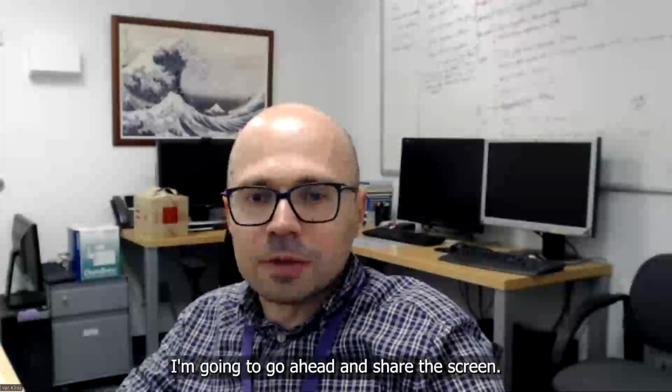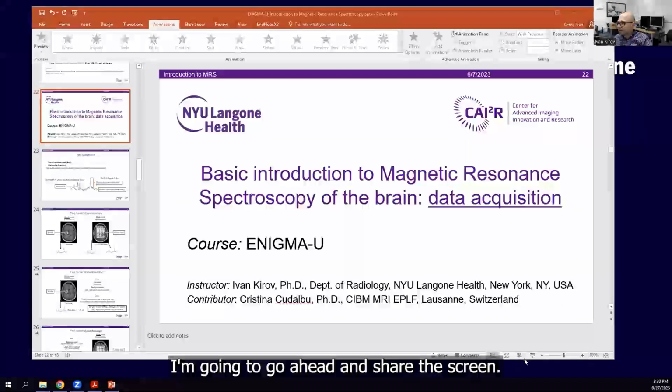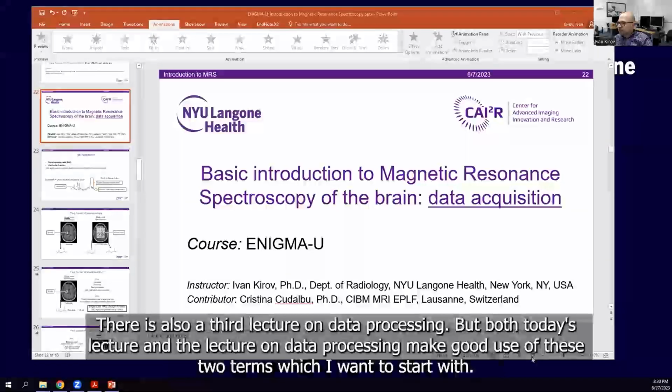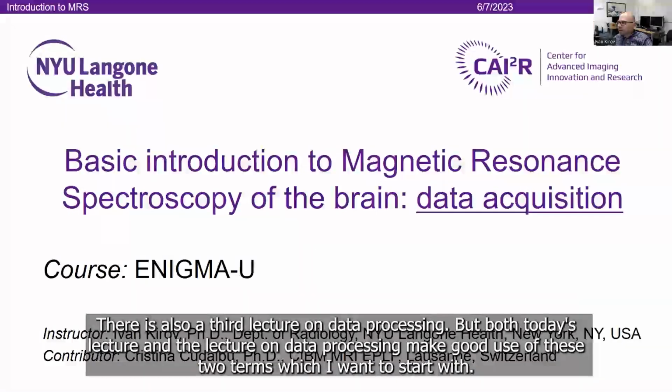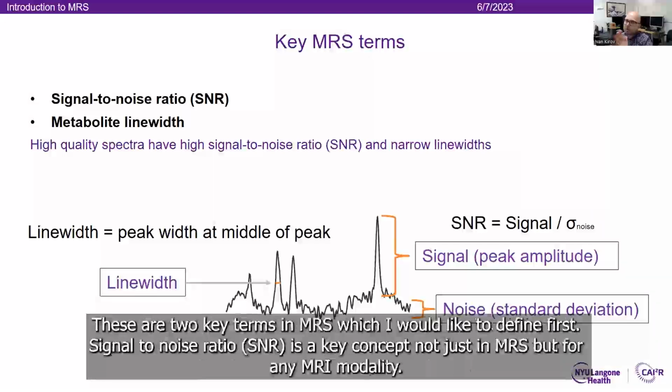I'm going to go ahead and share the screen. There is also a third lecture on data processing. But both today's lecture and the lecture on data processing make good use of these two terms, which I want to start with. These are two key terms in MRS, which I would like to define first.